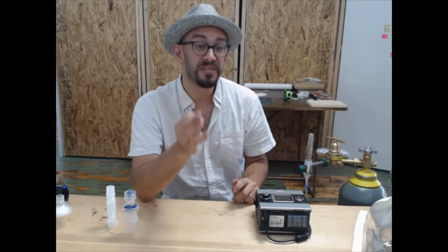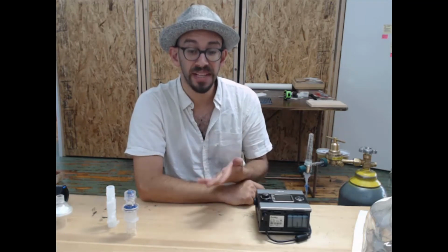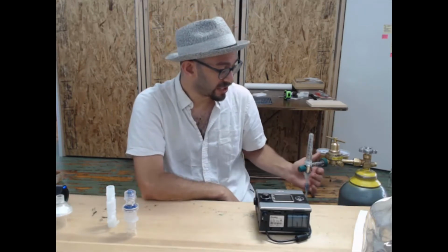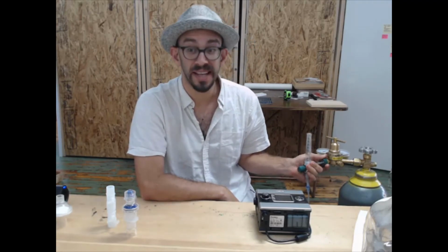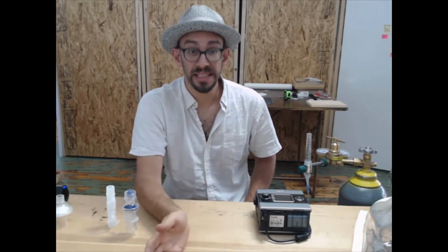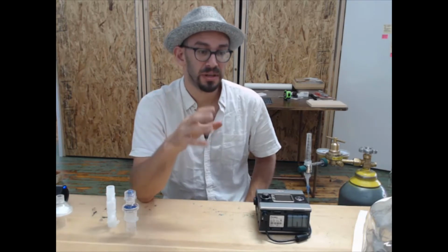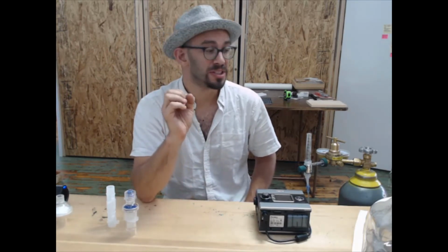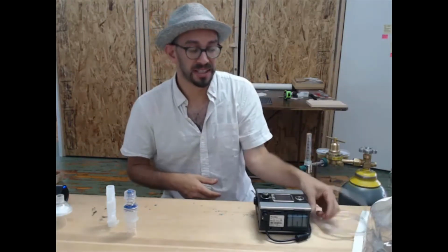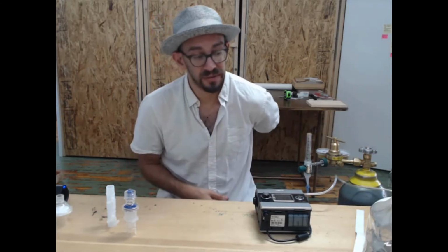And something that will be very, very convenient is the following. The majority of tanks often have a 15 liter a minute low flow regulator. Hospitals also often have higher flow regulators. The one I have on here is a standard hospital issue one that can go up to 70 liters a minute. If you can get a regulator that can achieve at least 35 liters a minute, everything gets easier because you are not combining multiple tanks to get higher oxygen flows. You can work with one tank, your logistics are simpler, your settings are simpler, and the opportunity for error is much less. Really recommend, if at all possible, you find a high flow regulator and ensure that you have sufficient supply of oxygen in your hospital.